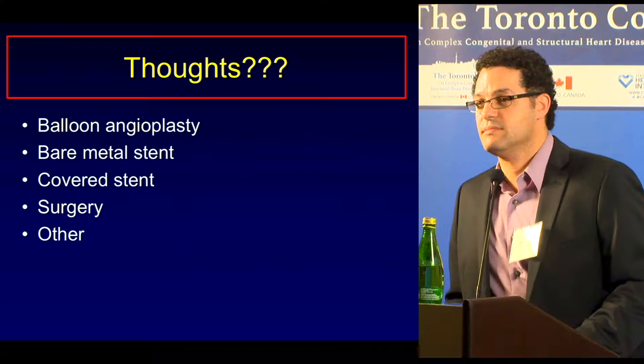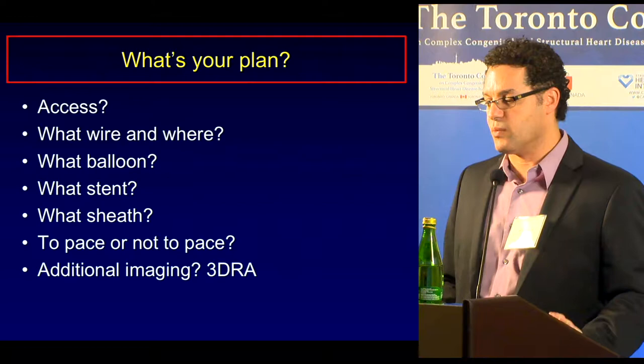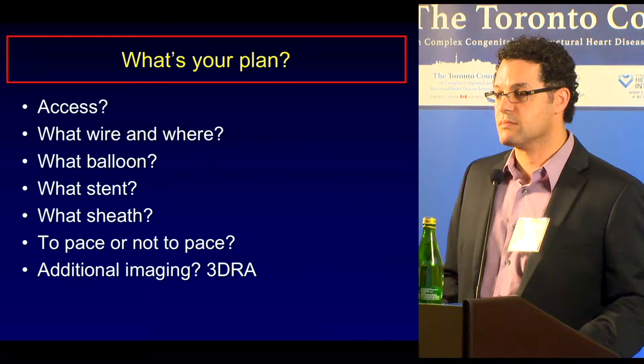Surgery? Other? Something I didn't think of? Okay. Now then you have to start thinking. What's your plan? Where are you going to access? What wire? Where are you going to go? What balloon? So question. The interposition graft, I'm sorry, you said is artifact from the SVC balloon? Or is that actually some aneurysm? It was an aneurysm. Of the interposition graft.